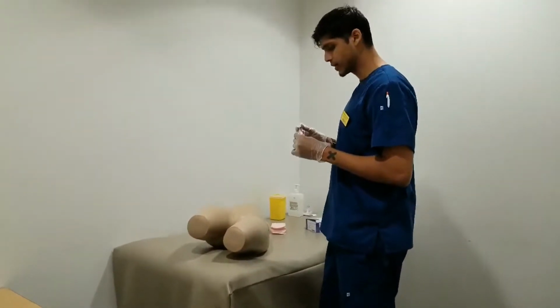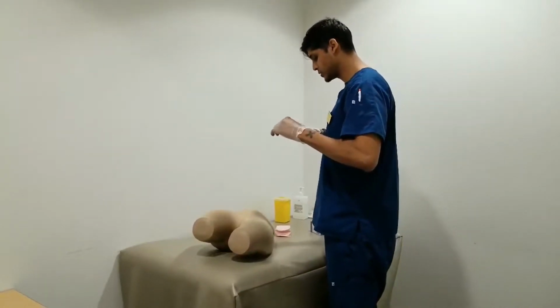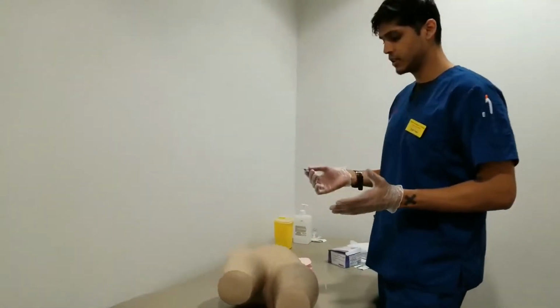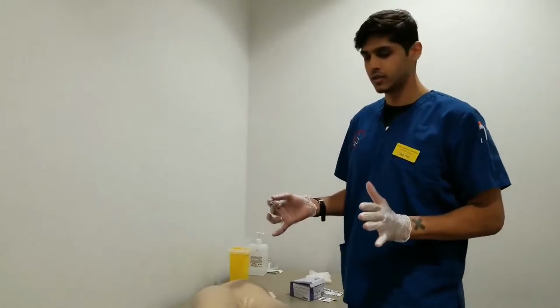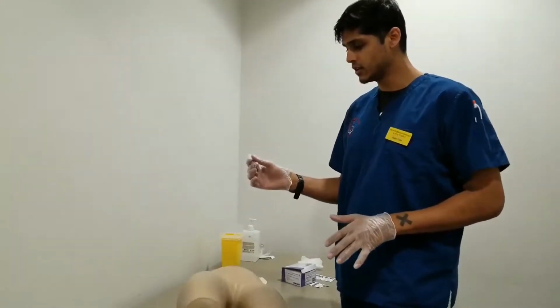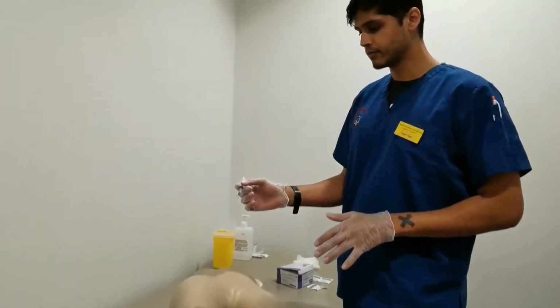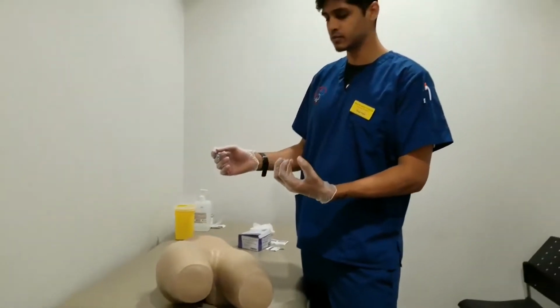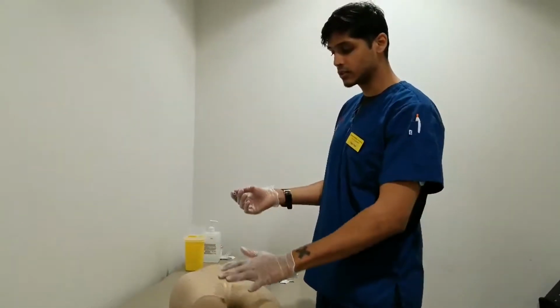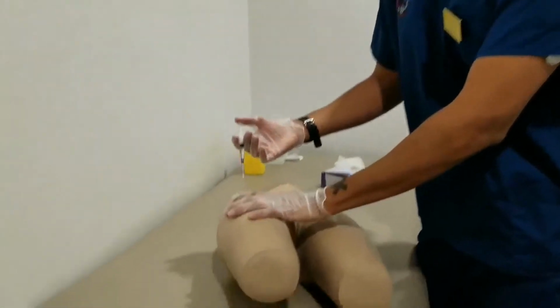Alright, so we have our right gauge, we have the right syringe, we have our medication ready. We have the location set. Mr. Mancini is, I would say, around an average weight-wise within BMI. So due to this fact, I'm going to be injecting the subcutaneous injection at a 45-degree angle, just to make sure I don't go deeper than that. As well, he doesn't have much weight, or he's not too obese, so I won't be doing a pinching technique. I will just cover the area. Okay, so at a 45-degree angle.